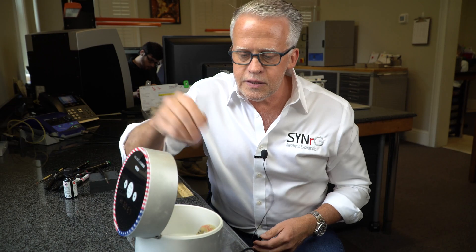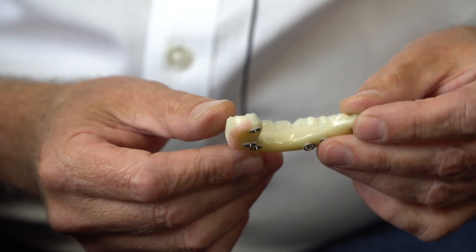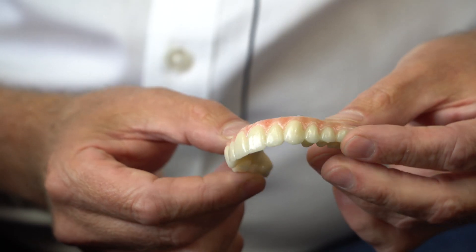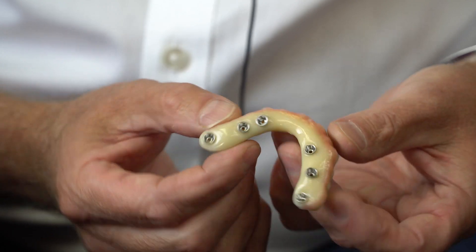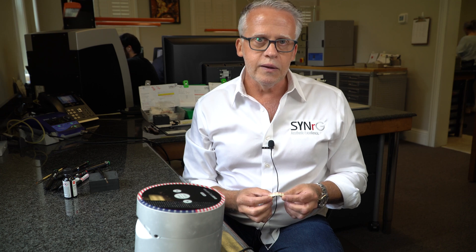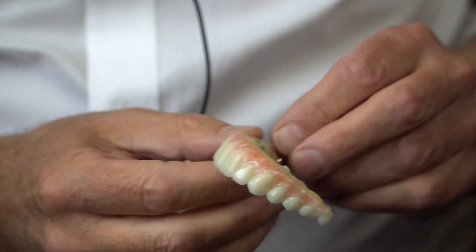All right, let's take a look. Freshly glazed, right out of the light box — a fully completed restoration. About 24 hours from the time that we received the files, tie bases cemented in, pink aesthetic added. The reason why we were able to do this so quickly and so accurately is because we start out with a plan, and that's a digital plan. This is ready to go back to Chicago to its new rightful owner.